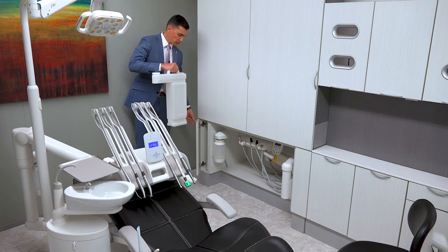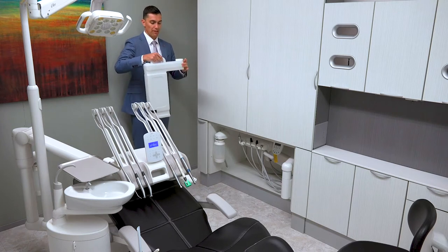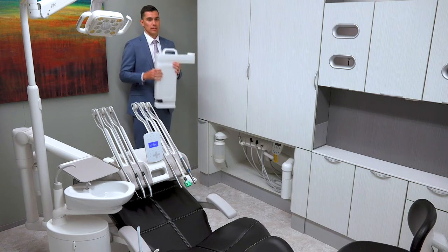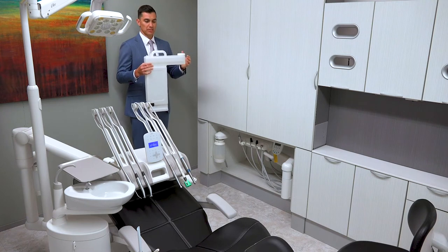From there, we'll fill this up with water and the vacuum line cleaner solution. This tank is a two-gallon tank — eight liters of water and solution. Each individual cycle runs one liter of solution through your lines, so you'll have eight full cycles in this tank.